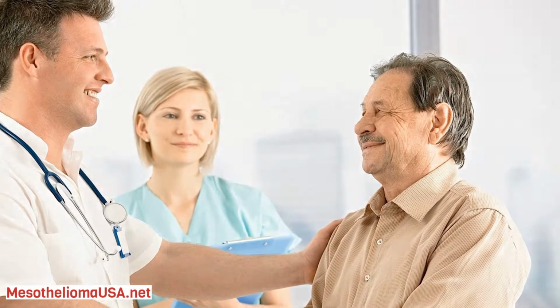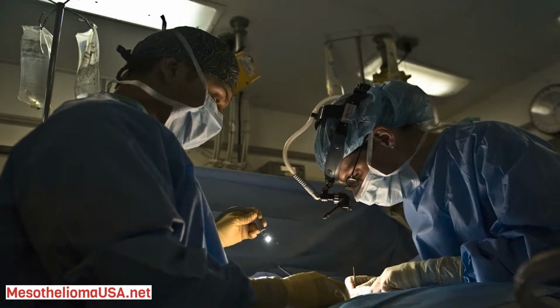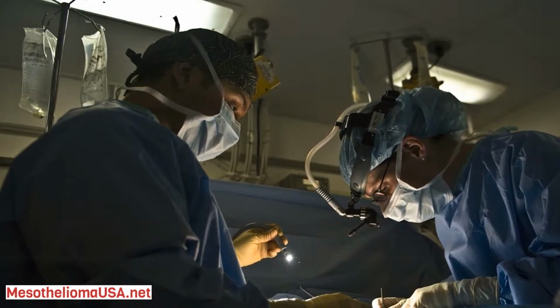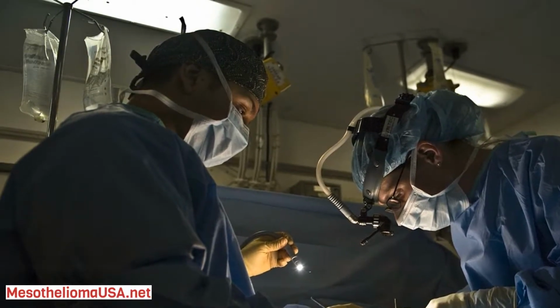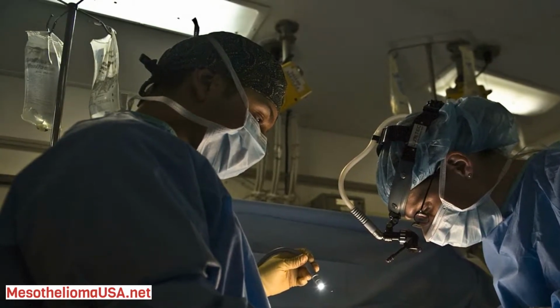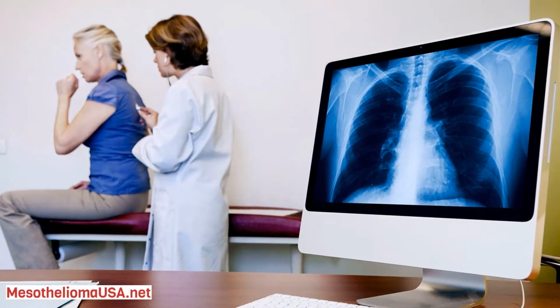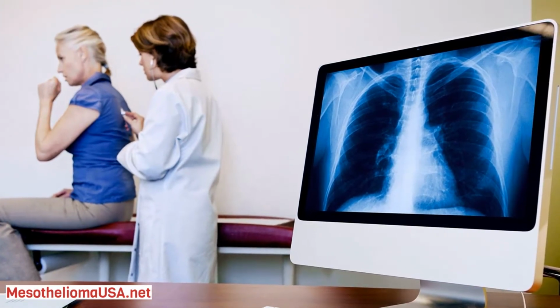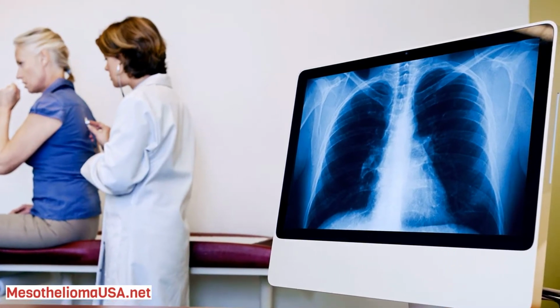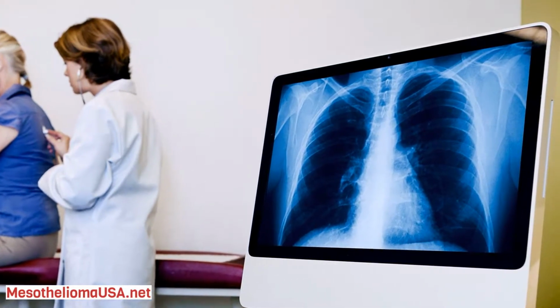Data analysis was carried out using SPSS version 16, and the ability of CT scan to differentiate malignant pleural mesothelioma and metastatic pleural diseases was investigated. Results. Totally 29 males and 26 females were assessed in this study. Based on pathology, 17 MPM and 38 metastatic pleural malignancies were diagnosed. According to CT study, about 82% of the patients with MPM and about 79% of the patients with metastatic pleural diseases were correctly diagnosed by a radiologist.